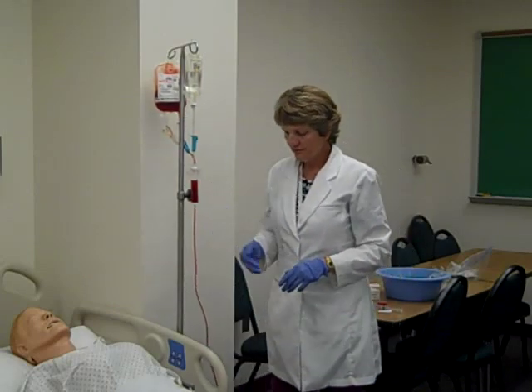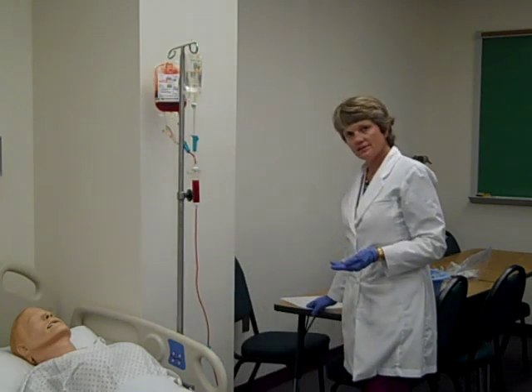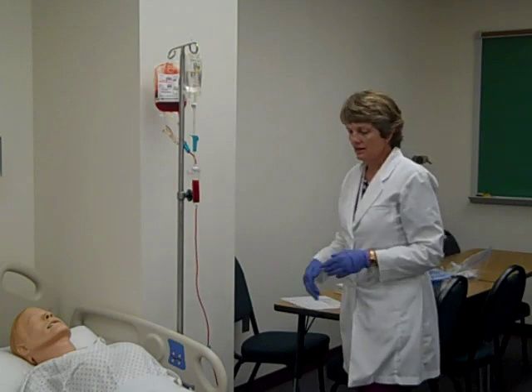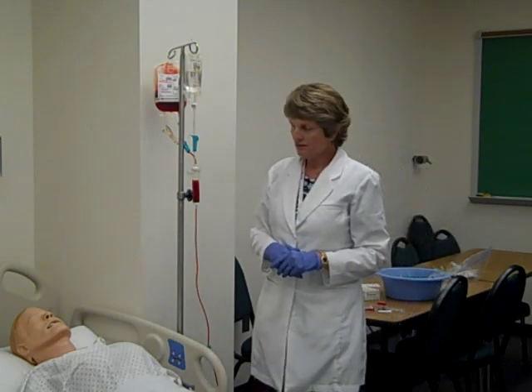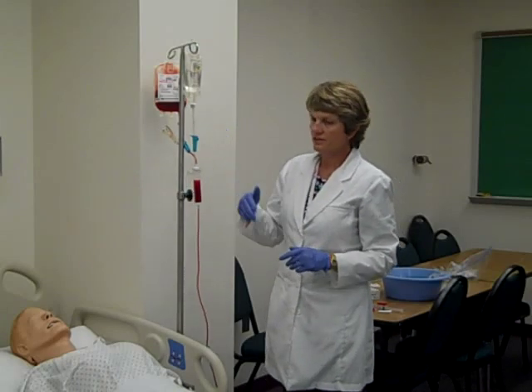So we're going to go ahead and flush the line, and we're going to make sure that you take vital signs post-transfusion and document them on the flow sheet. And we need to do that before we actually start flushing the line.